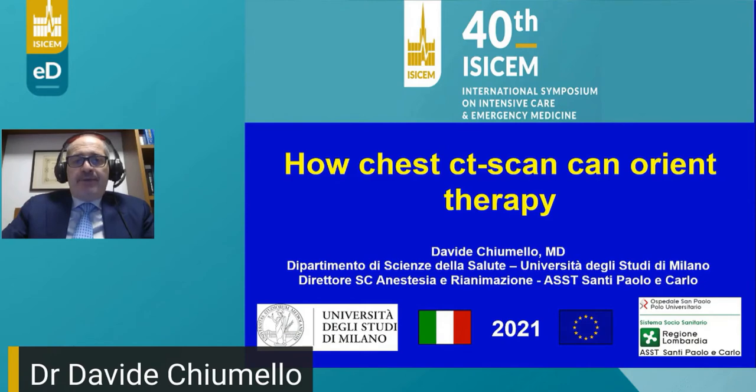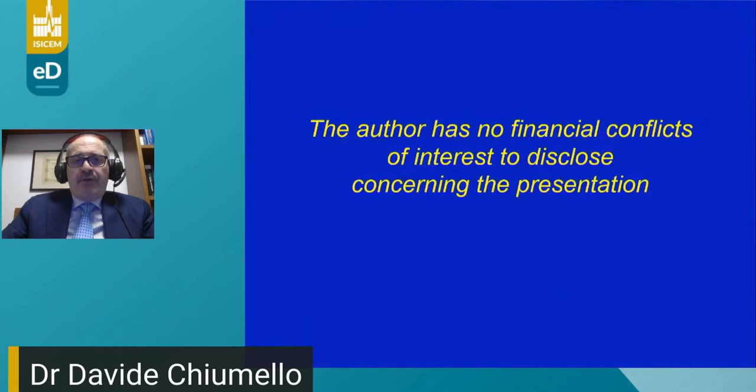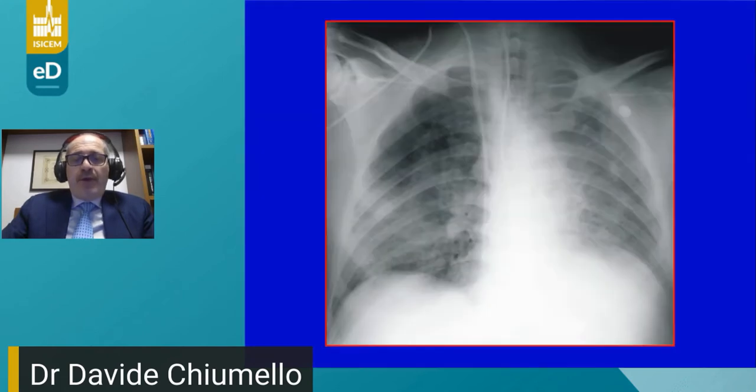In the next 15 minutes, I will deal with the topic of how chest CT scan can orient therapy. I have no conflict of interest. And why we have to use CT scan.